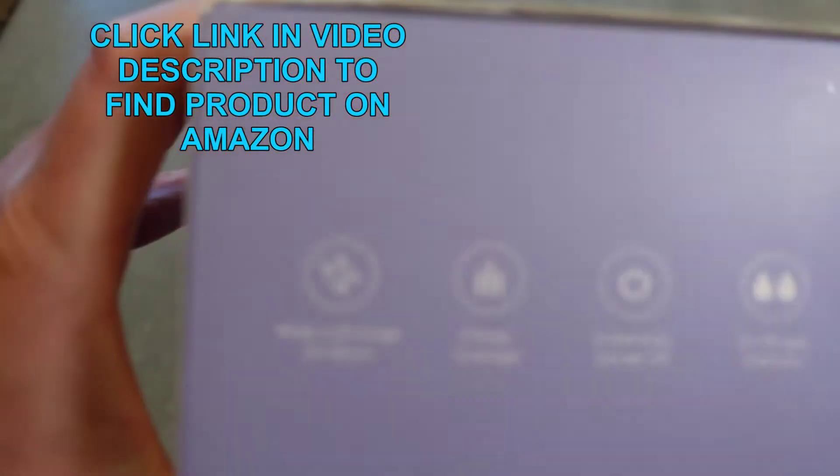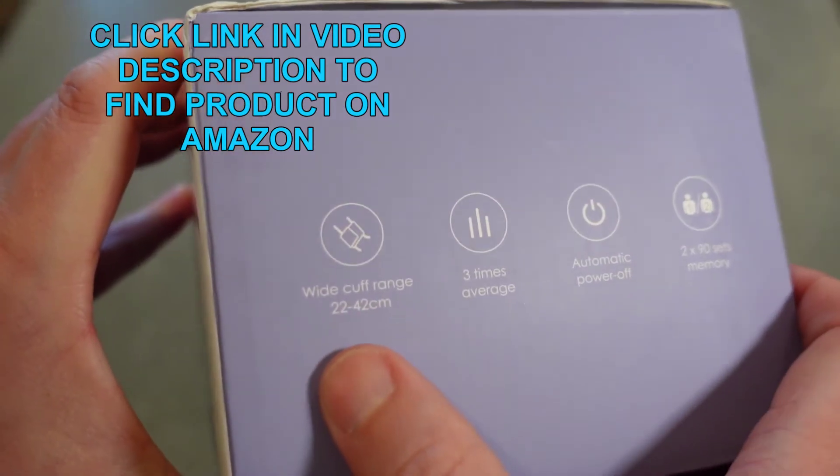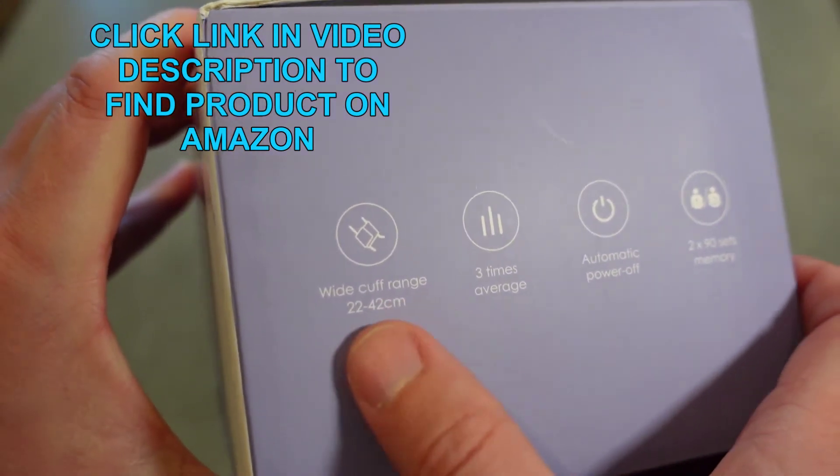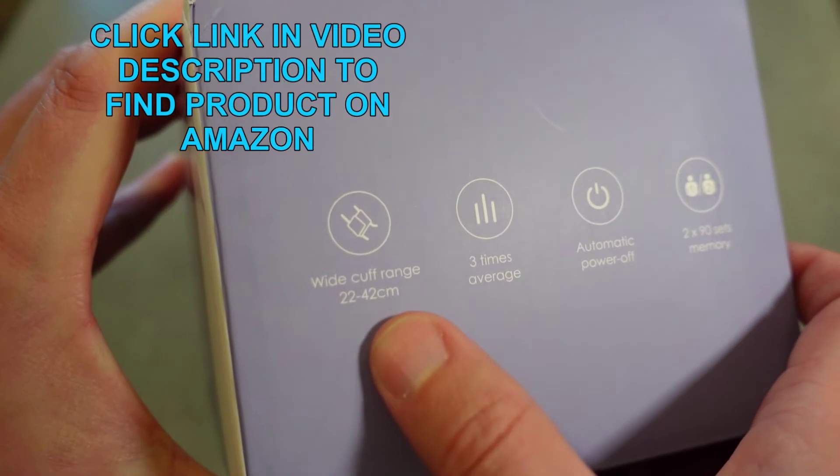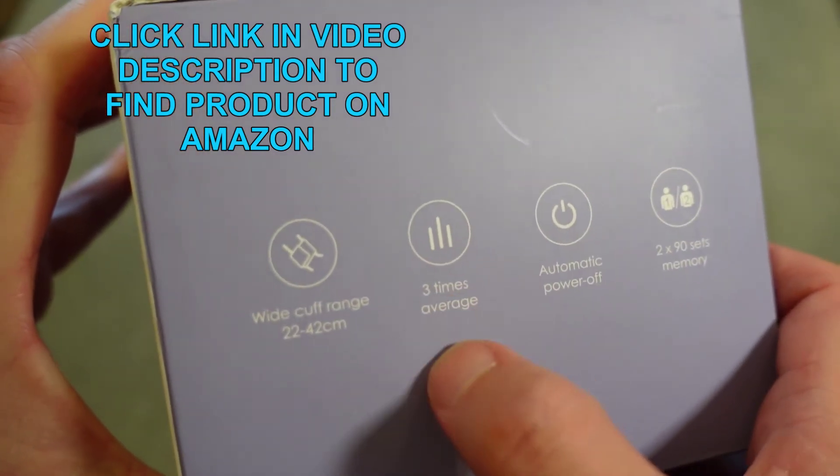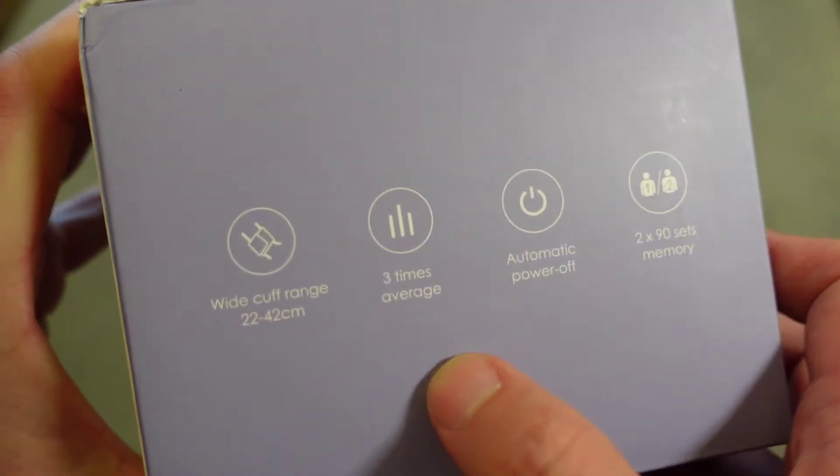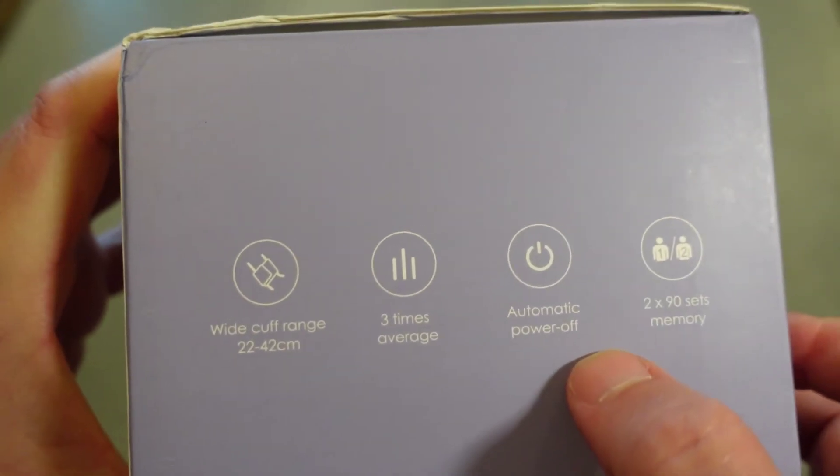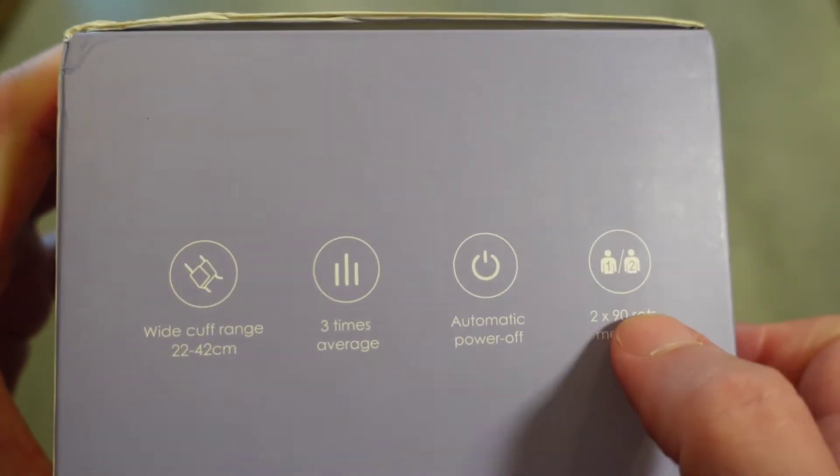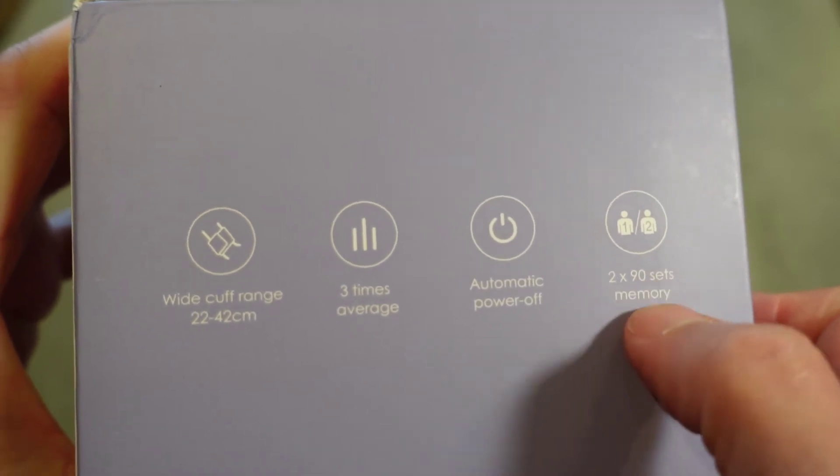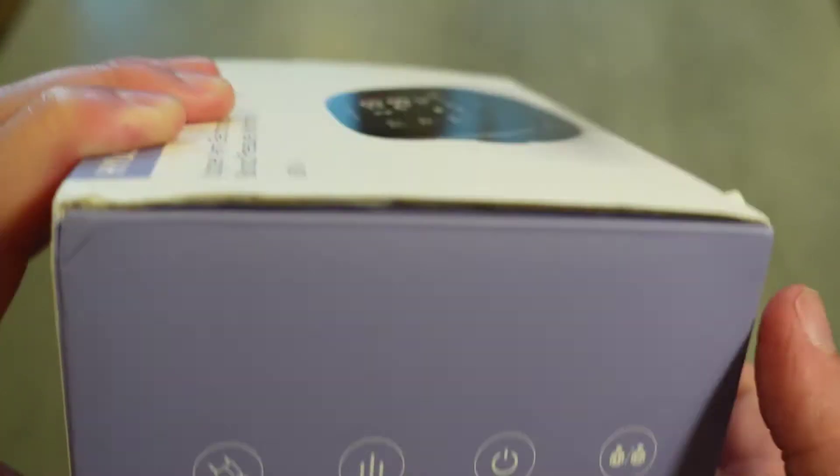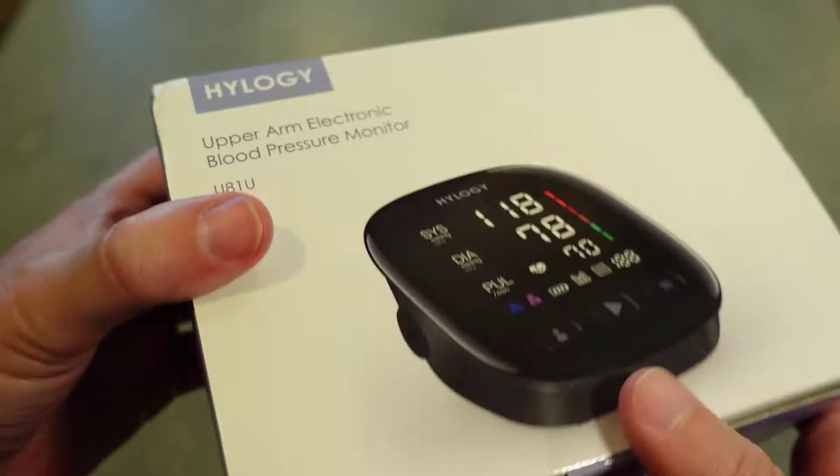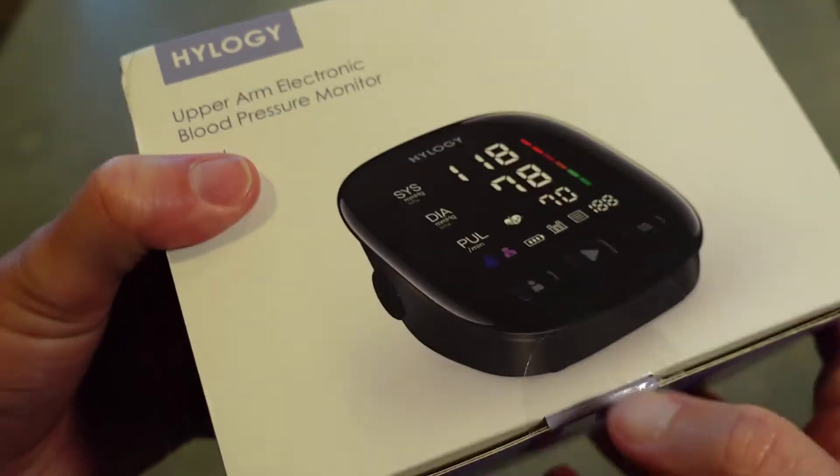Some of the other features you have are talked about here. It's got a wide cuff range so it fits smaller arms and larger arms. It does a three-time averaging of blood pressure. It has automatic power off and you've got two people that you can recall 90 sets of measurements. So lots of cool features.